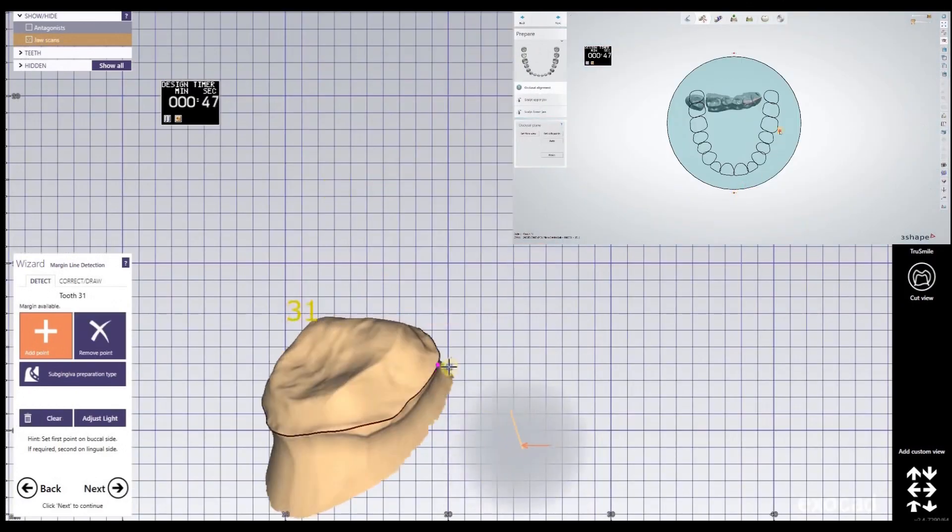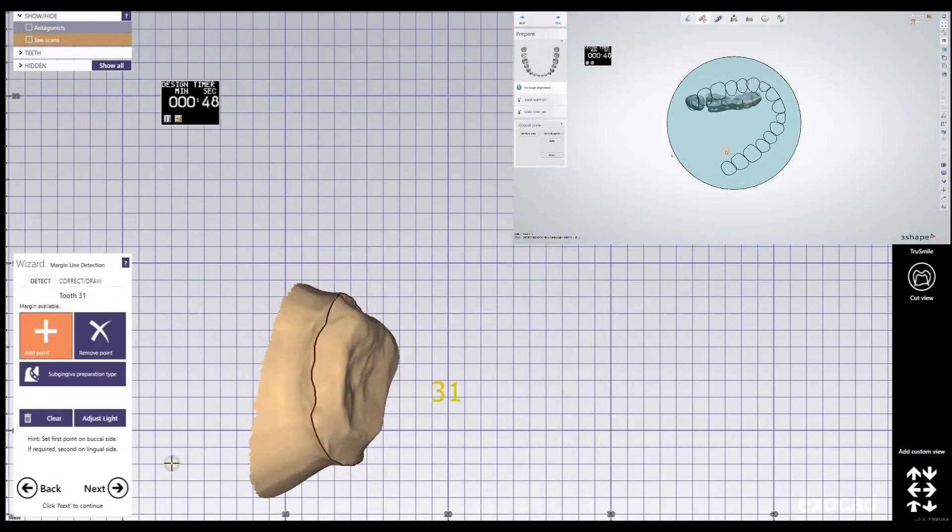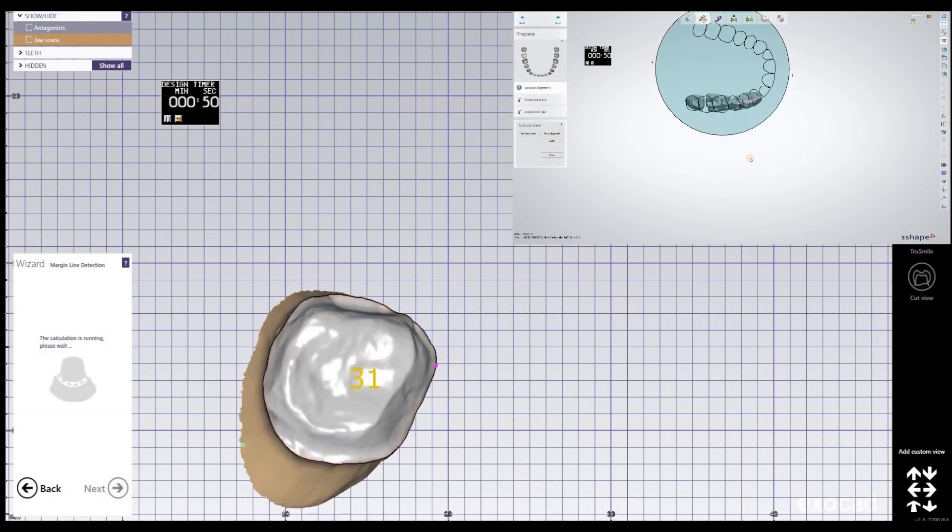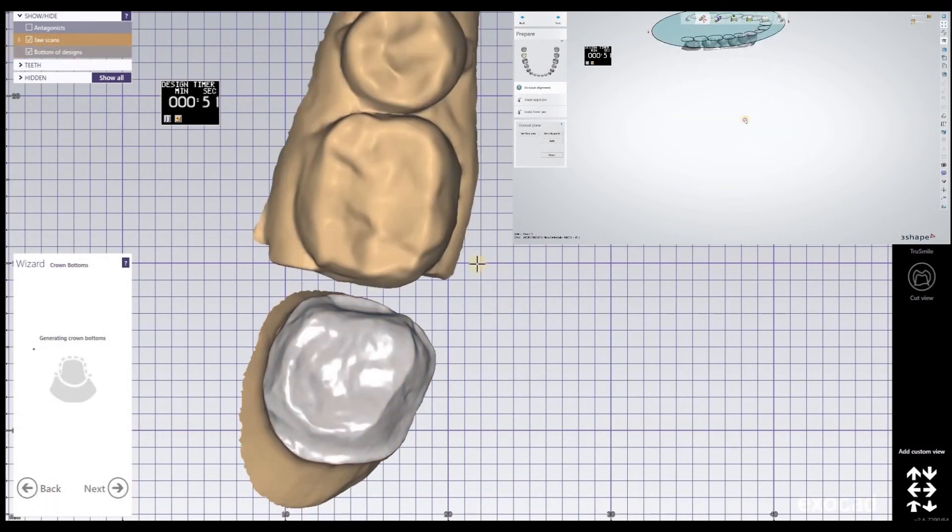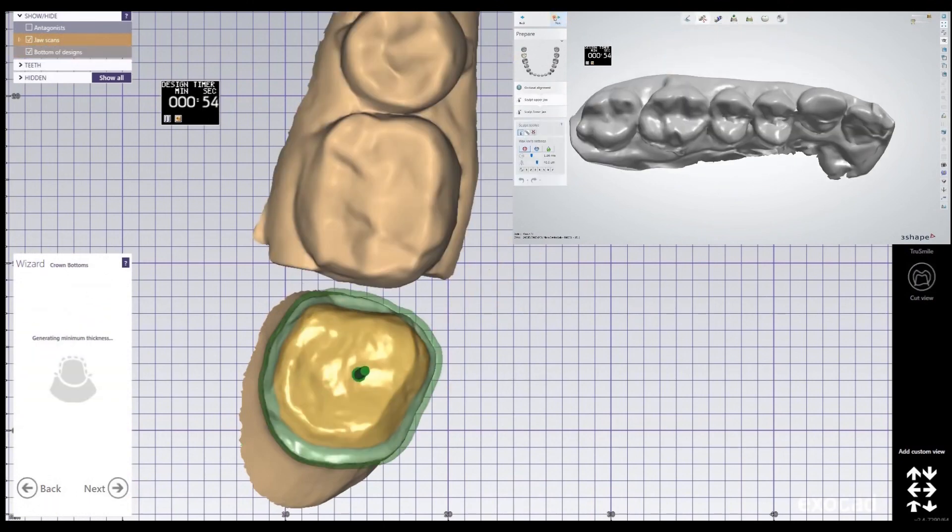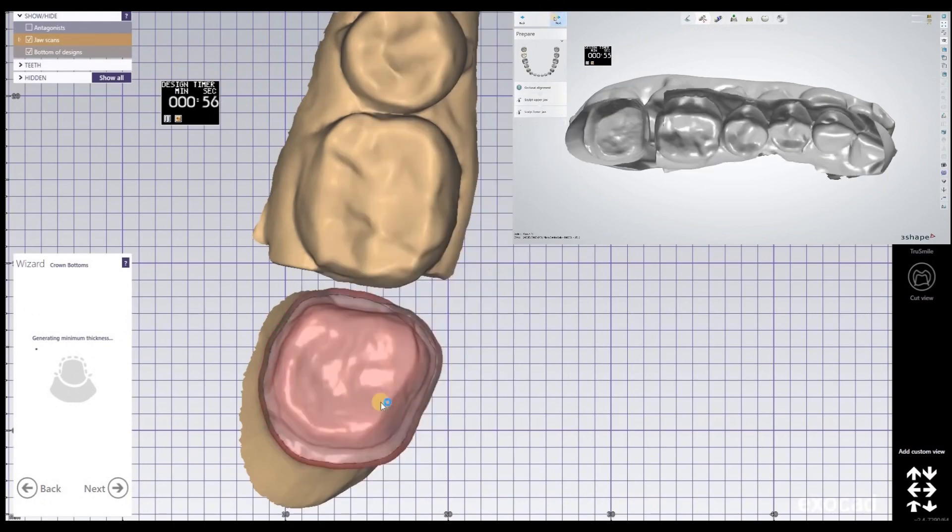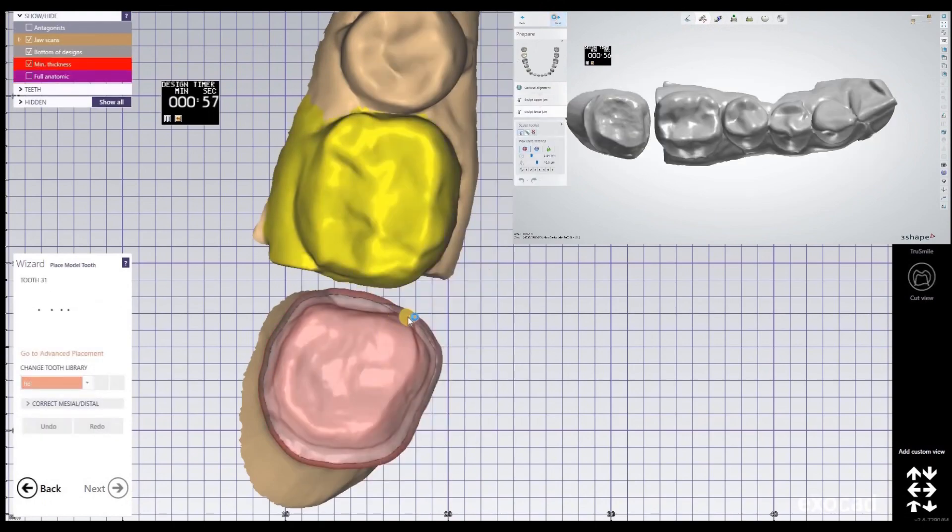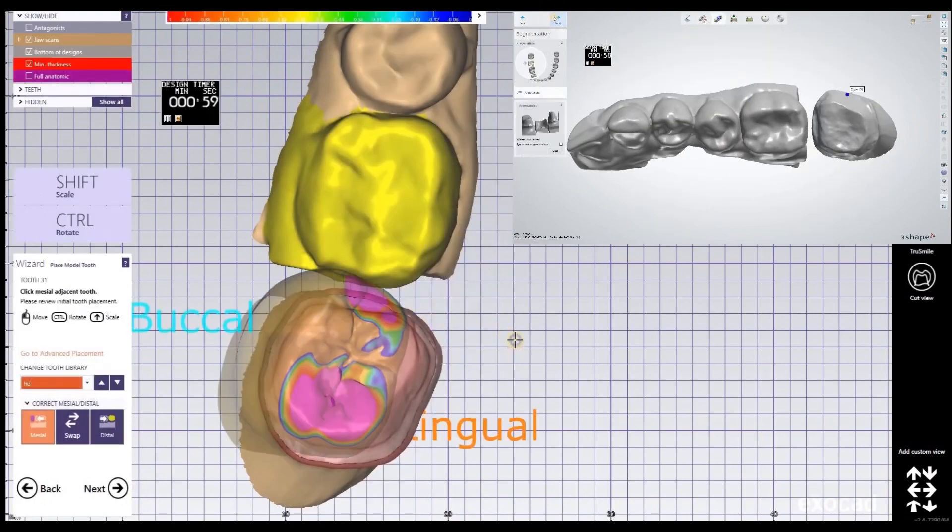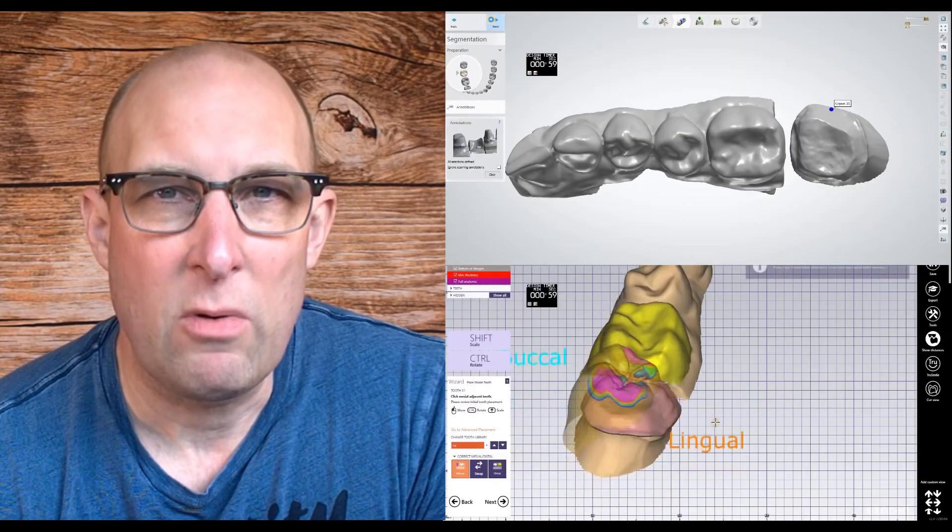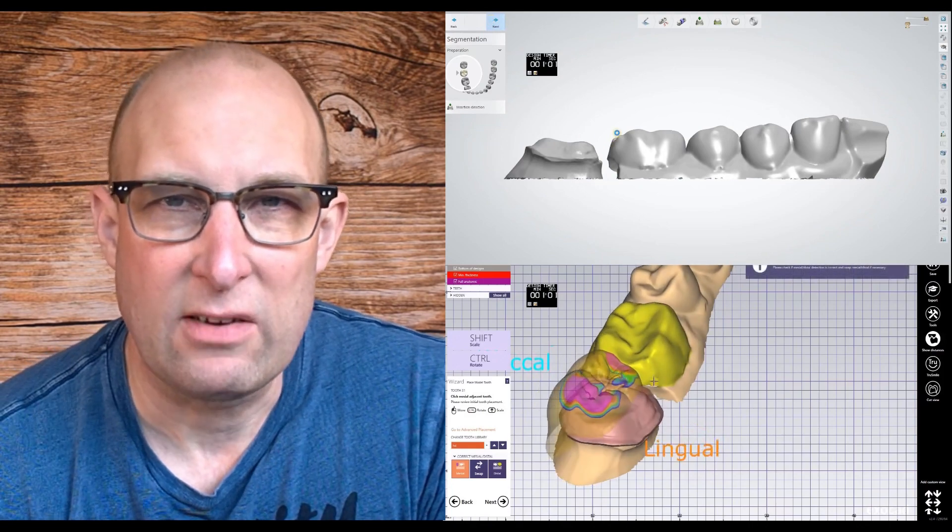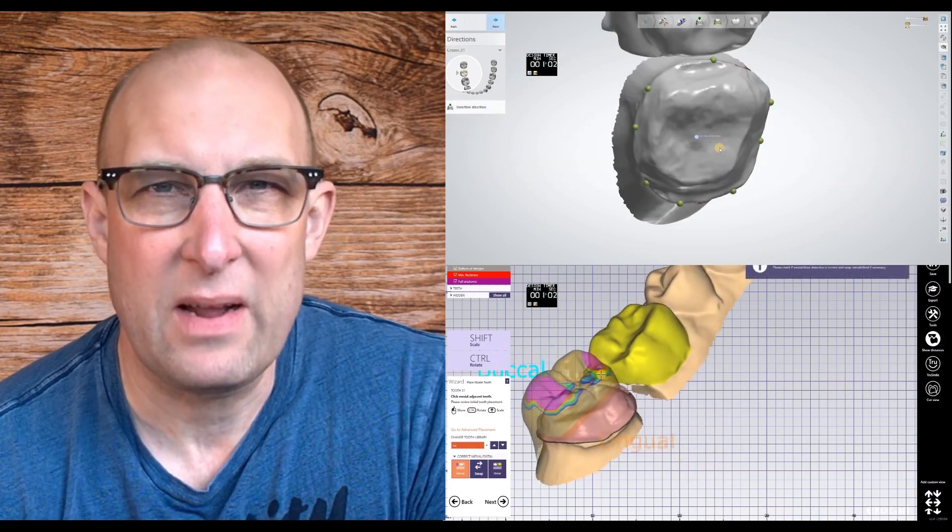I like what exocad does with the margin line - I just click on it and it automatically finds the entire margin. Three shape can have some problems here. I'm already done with insertion direction in exocad. I'm not a big fan of how three shape solves this problem.